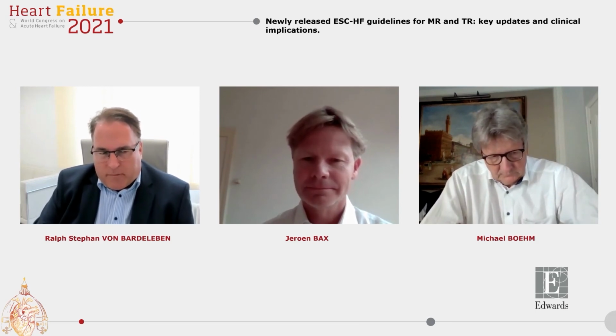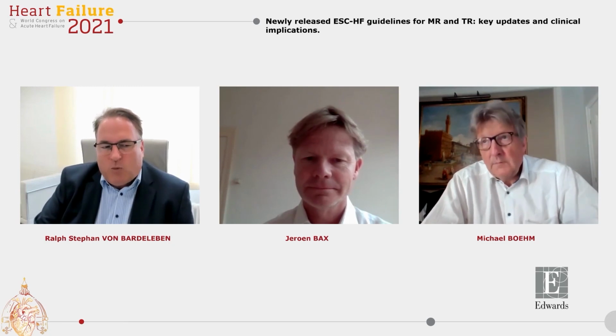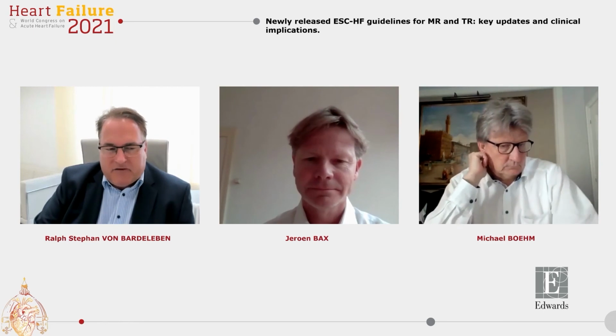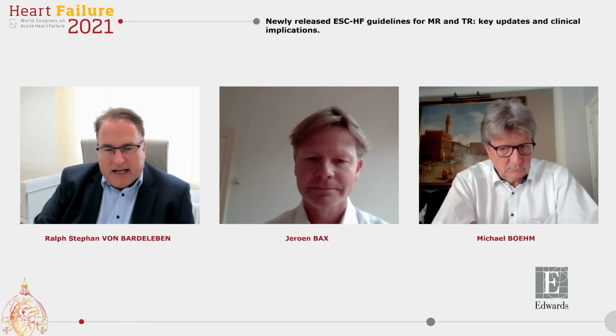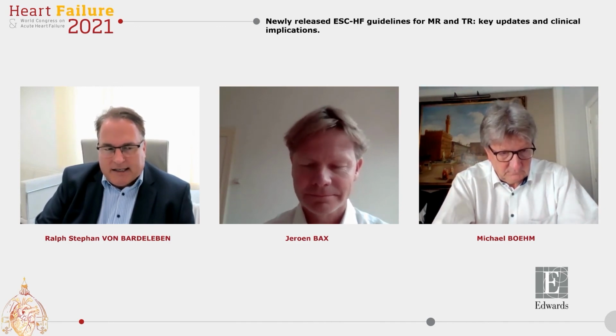So it's not only the COAPT patient, I have to say that, but in COAPT-like patients or in indexed ventricles below 100 cc per meter square and guideline-directed stable medication that does not yet have to be maximized, but has to be a combination of therapies, after a waiting period of, in my opinion, 1 to 3 months, not to come too late. In a persistent, symptomatic, severe MR situation, you should add a transcatheter mitral valve repair to optimize remodeling and the positive effect on outcome for those patients. And I think this has been shown nicely.